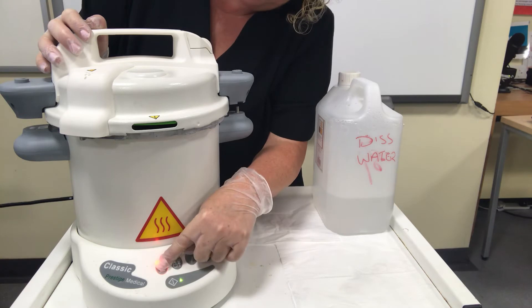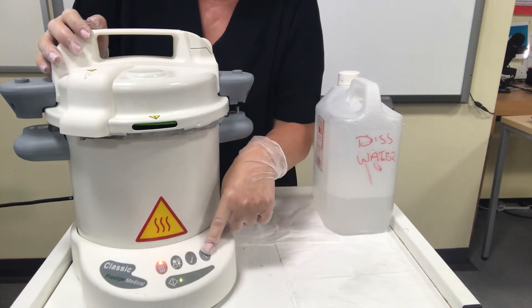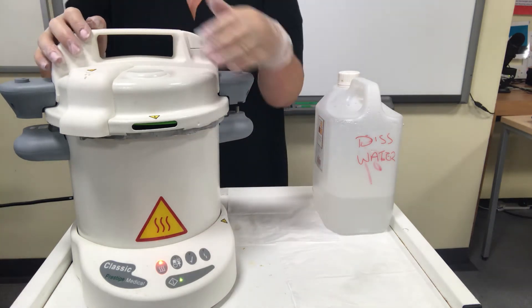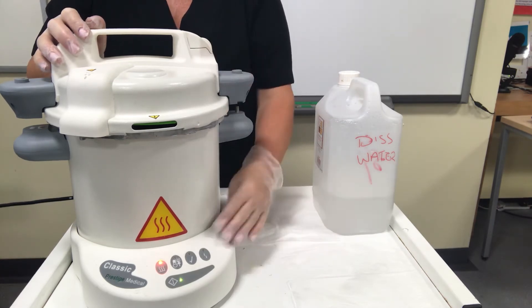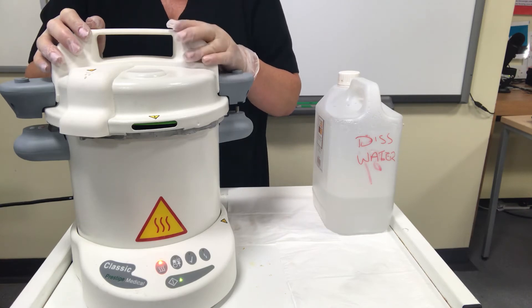You've got a light to indicate that it's on, that it's reached temperature, that it's complete, and that the tools are able to be taken out. Once it has gone through the process — about 10 minutes — it will beep and you'll know the tools are ready.